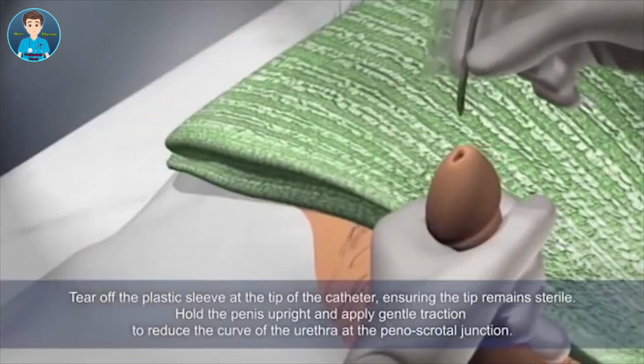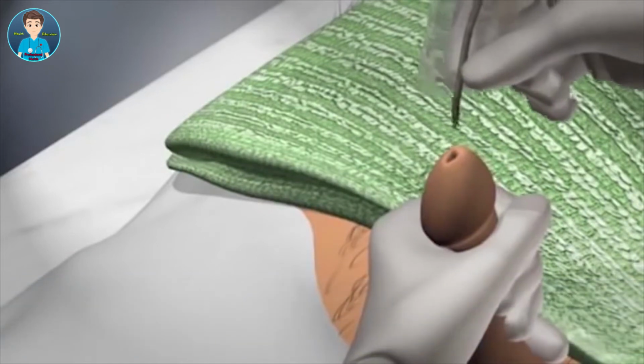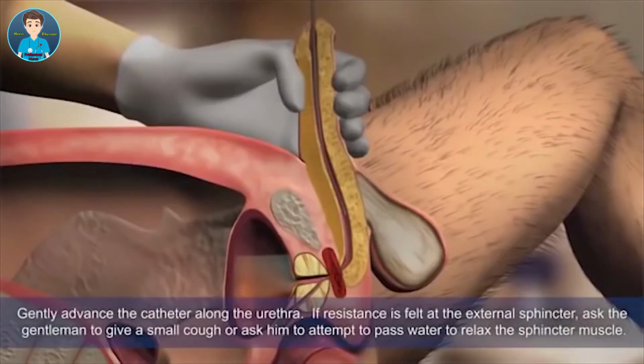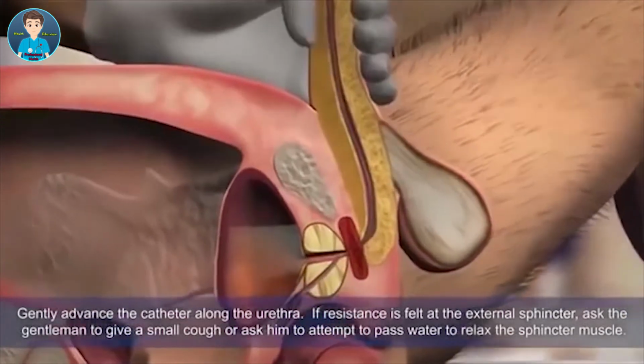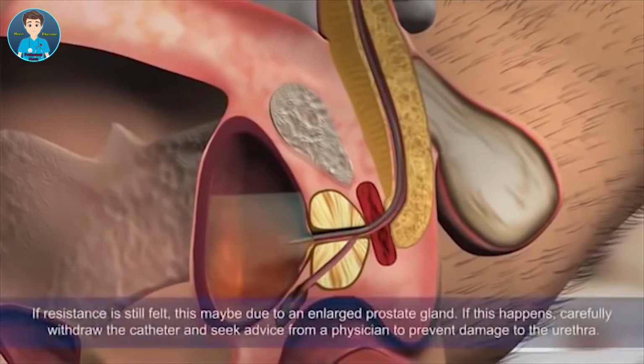Hold the penis upright and apply gentle traction to reduce the curve of the urethra at the penile-scrotal junction. Gently advance the catheter along the urethra. If resistance is felt at the external sphincter, ask the gentleman to give a small cough or ask him to attempt to pass water to relax the sphincter muscle. If resistance is still felt, this may be due to an enlarged prostate gland. If this happens, carefully withdraw the catheter and seek advice from a physician to prevent damage to the urethra.